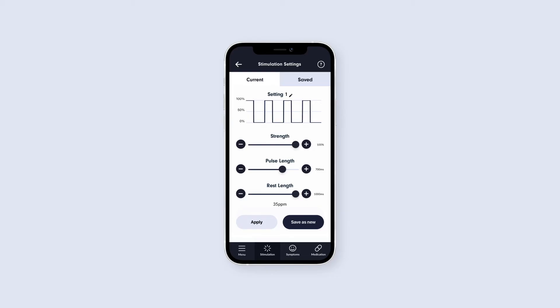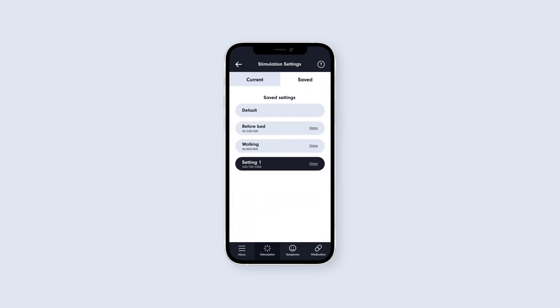To view your previously saved presets, tap on the Saved tab at the top of the screen. You can then apply any of these to your Q1 by tapping on the preset.